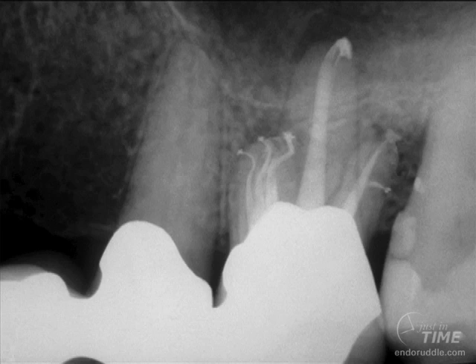buccal system. So here we have a maxillary molar. It's carrying a long splint. It's tied up in reconstructive dentistry, and this is the rationale for treatment. We are to remove all the pulp so we can have the best possible chance for a long-term successful result.